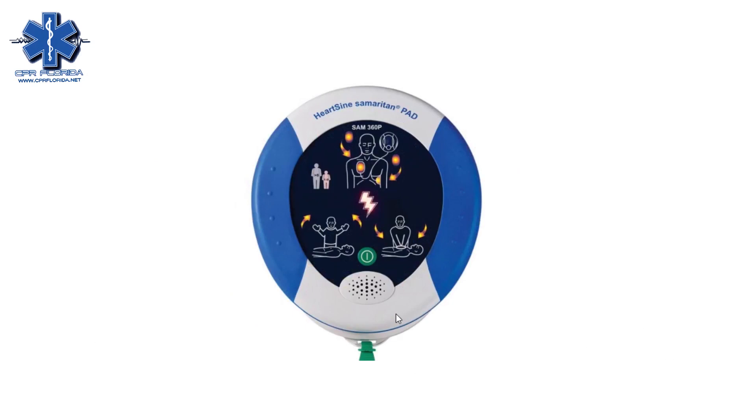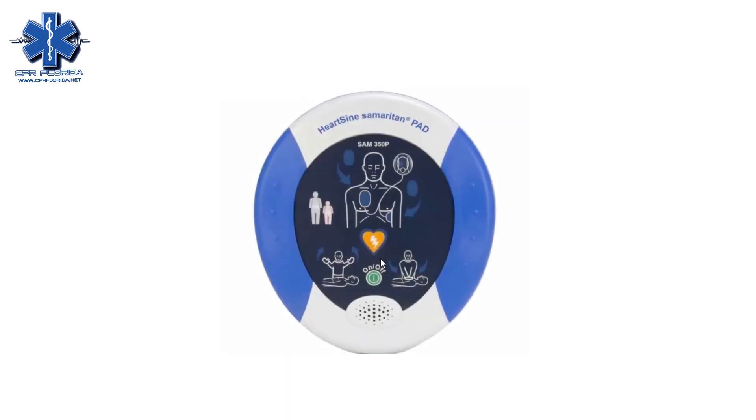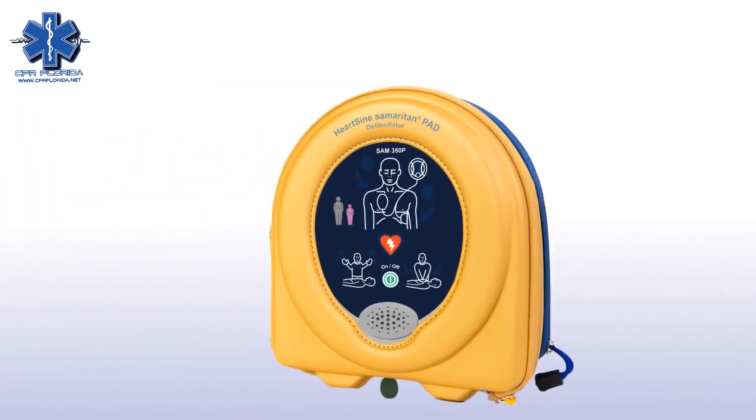Here is the 360 model of the Samaritan. It is the fully automatic model, so there is just the on button — you place the pads on the victim and it will shock on its own. There's also the semi-automatic where you actually have to push the shock button. Either way, it's an easy way to save a life. Let's look at how to use one in a life-saving situation.